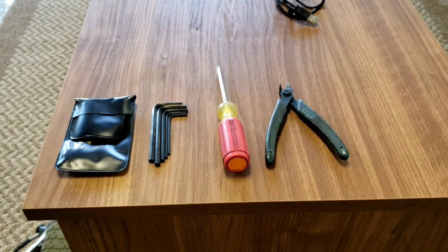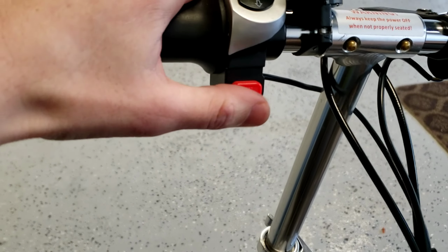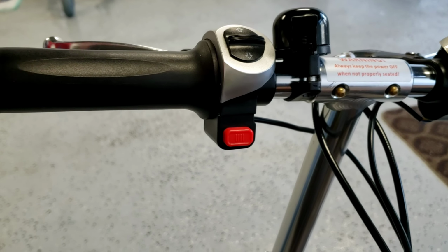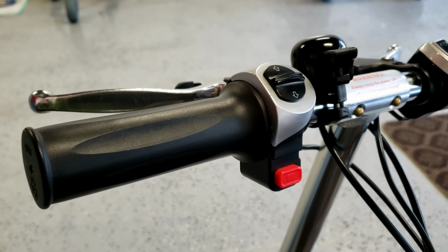All right, so we're going to show you how to fix a sticky button. This one is fine, but it appears that you have a problem with this either being difficult to push in or difficult to get off. So we're going to go over really quick how to fix that. It's really easy, won't take long at all.